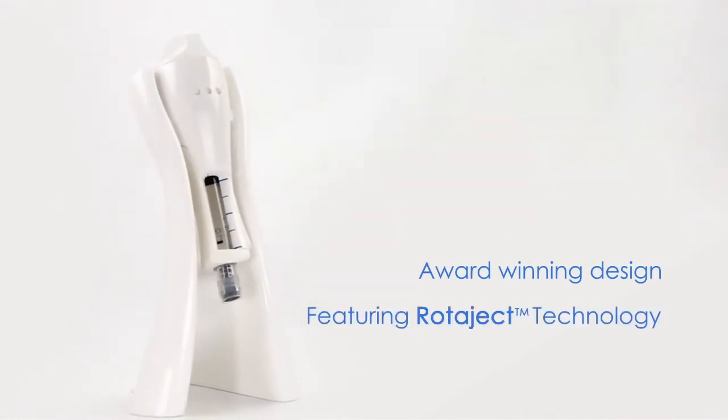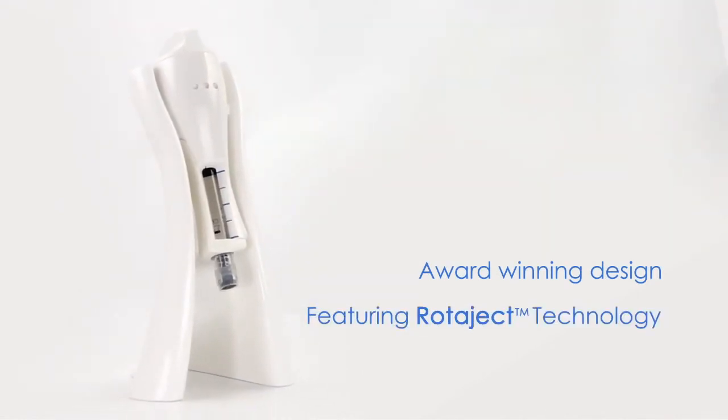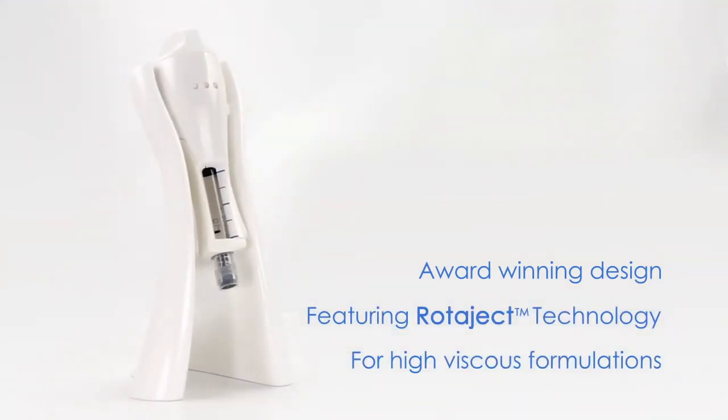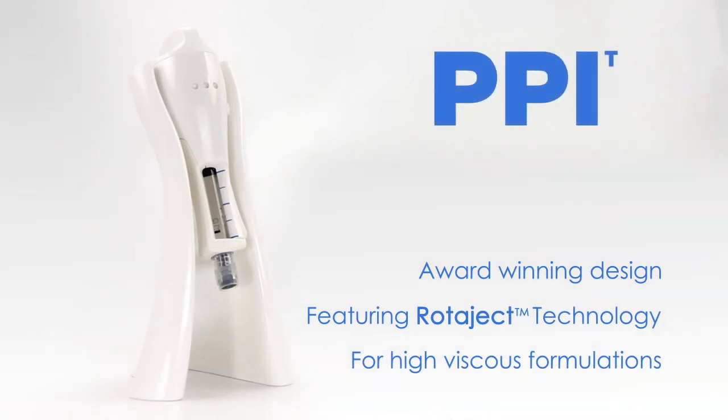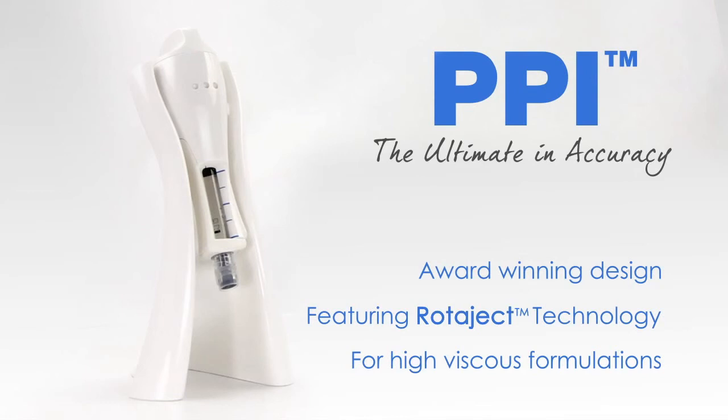An award-winning design, featuring Rotorjet technology, developed for high viscous formulations. The Precision Pen Injector. The ultimate in accuracy.